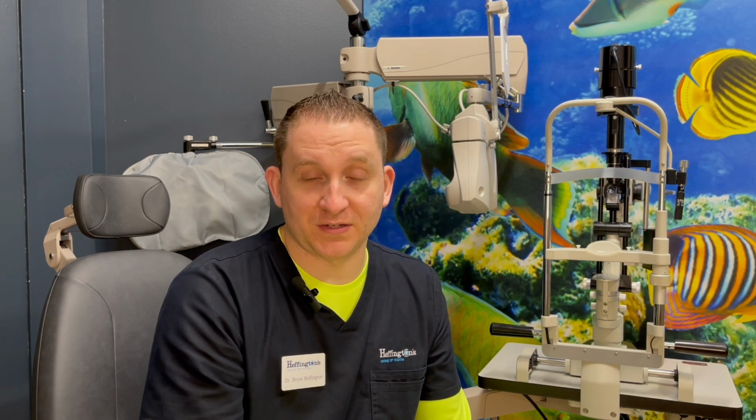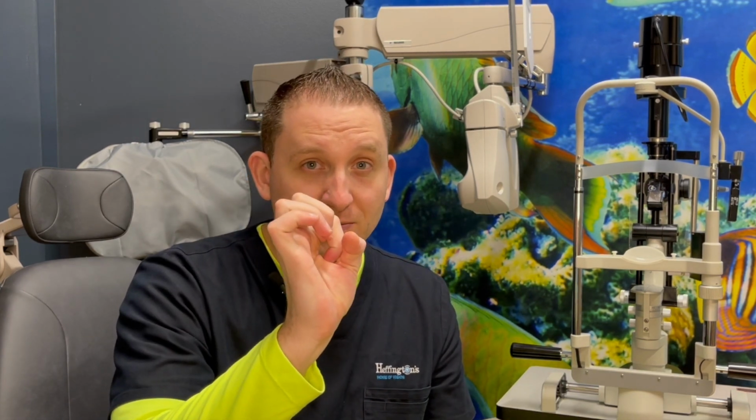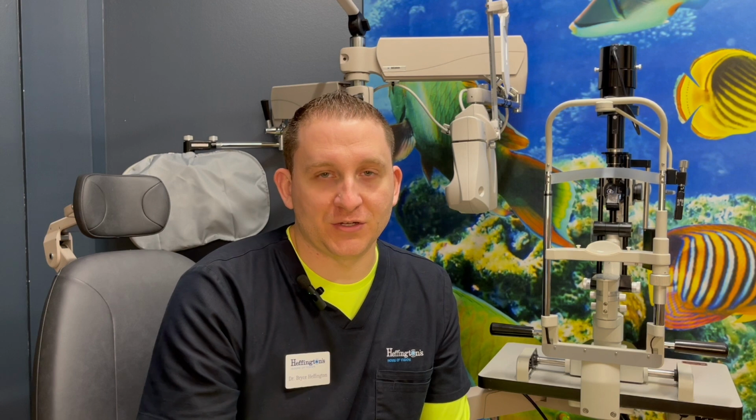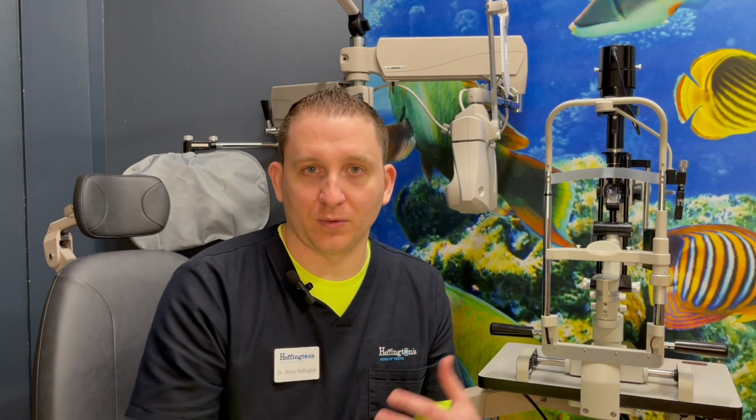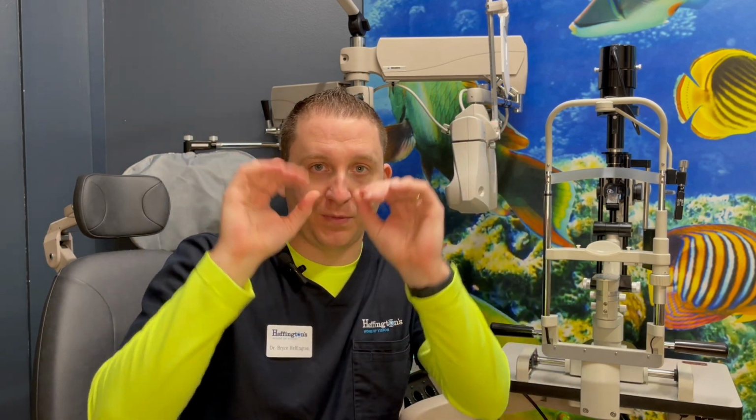Now, to get better fundus photos, sometimes we do like to dilate certain patients, meaning we put the dilation drops into the eyes to open the pupil up, because the light, when it's emitted from the camera to the retina, has to pass through that pupil. So if the pupil is really incredibly small, we're not going to be able to get that great of images. Or if there's a super dense cataract or anything like that that could be blocking the light image from passing effectively to the retina, we sometimes like to dilate patients' eyes in order to expand the aperture, open the pupil up a little bit more to get better image quality and to actually see what's going on inside the retina.